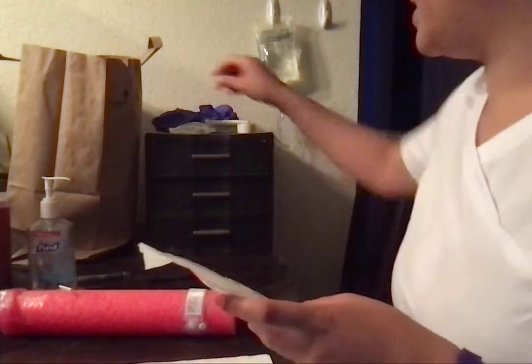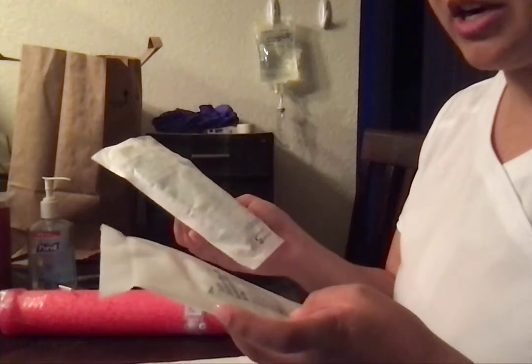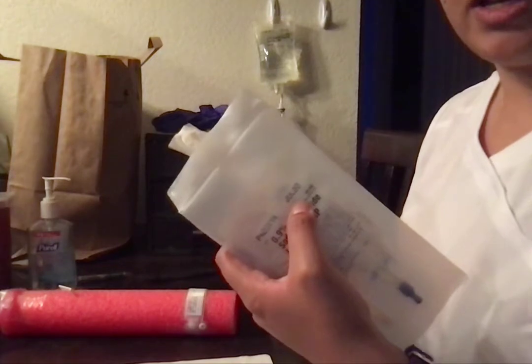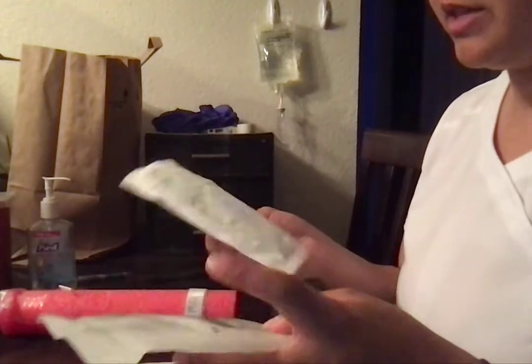So I have my medication. I'm going to grab a secondary line, and I'm going to look at the expiration date there. Oh, the expiration is July 2022. It's only May of 22, so we are still good there. Also, the package is intact. There's nothing in the medication that isn't supposed to be there. It doesn't look abnormally cloudy or anything like that.